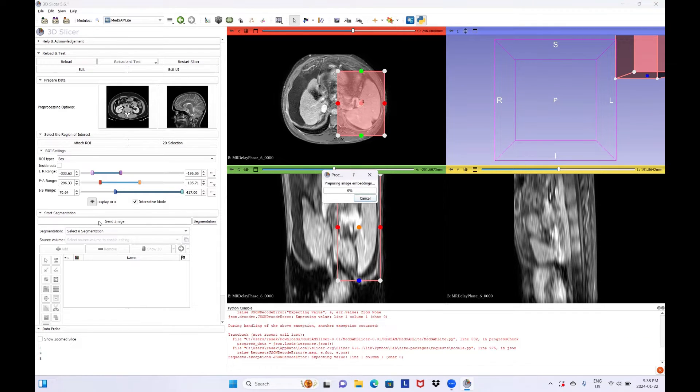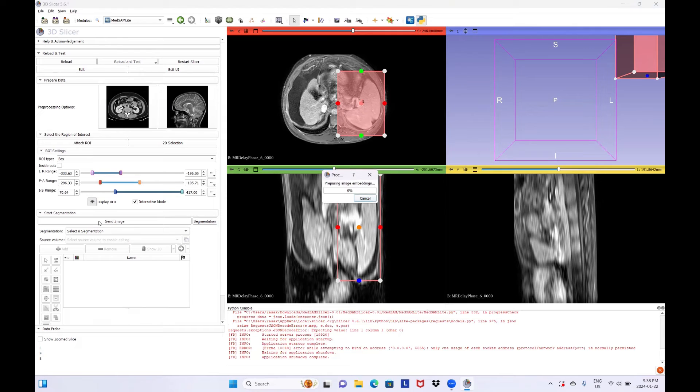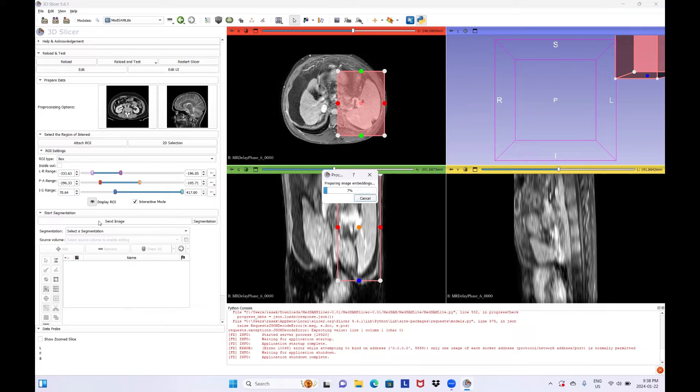You will need to do this step only once for each image. As long as the image is not changed, for example using a new preprocessing method, cropping, etc., you do not have to redo this step.